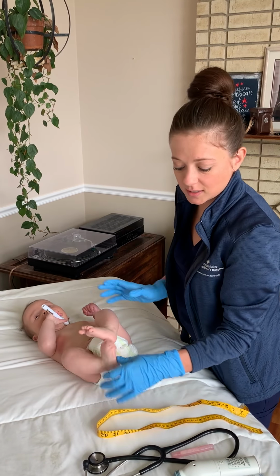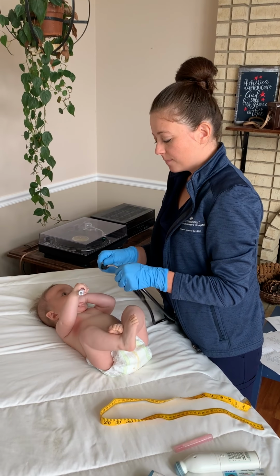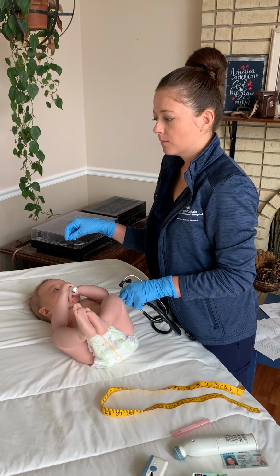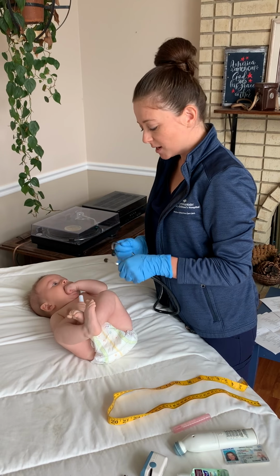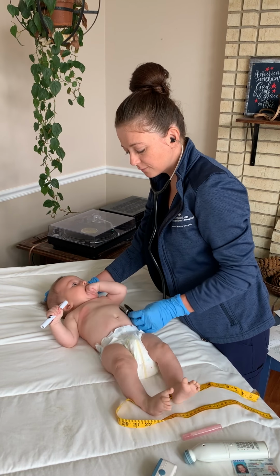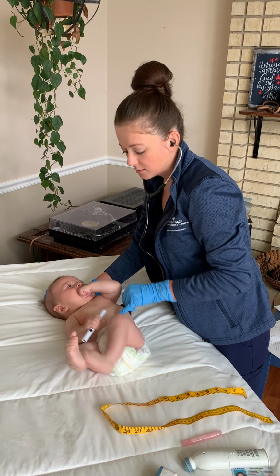I'm also going to listen to his lung sounds. Respiratory distress is one of the first signs of abnormality that leads to a diagnosis of bacterial meningitis. The younger the infant, the less specific the symptoms are. They usually just present with a more general picture of sepsis and then are later diagnosed with meningitis. So I'm just going to listen. I'm going to note his heart sounds, and then specific to respiratory, his lung sounds. I'm looking for clear equal bilateral lung sounds in all of his lobes, noting any diminished areas or areas of coarseness. He sounds very clear and healthy.